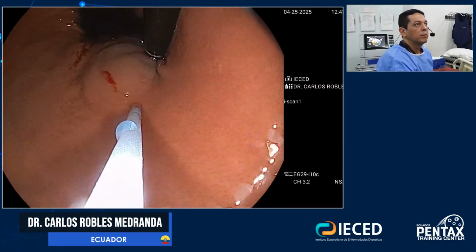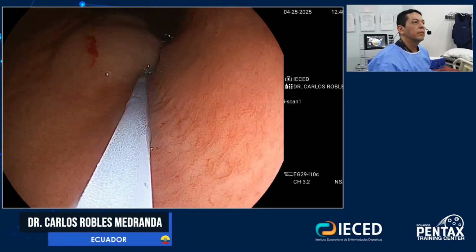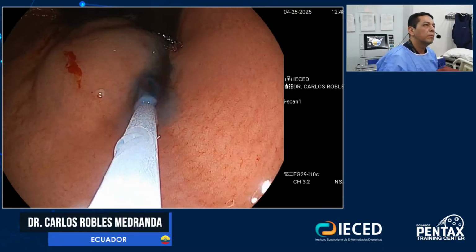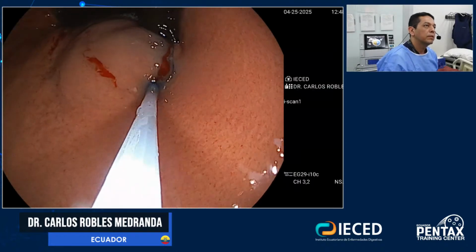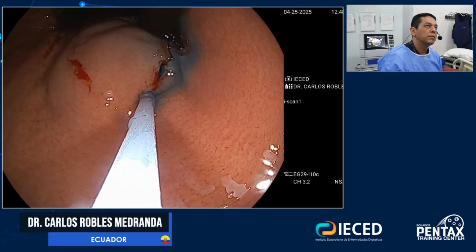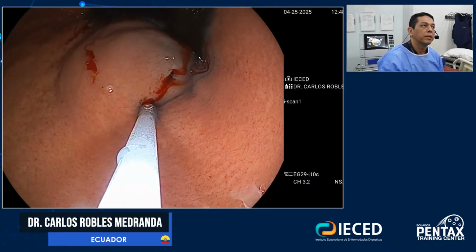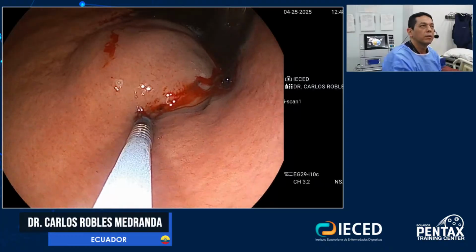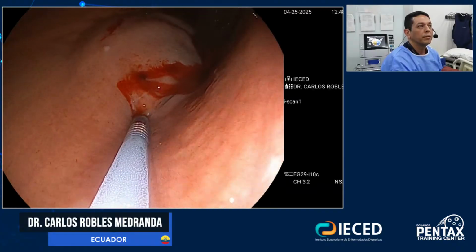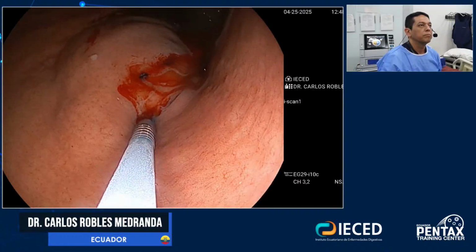Okay. Momento. Abre. Inyecta. Momento. Inyecta. Sigue. Para, retira. Para. Abre. Inyecta. Para, retira.